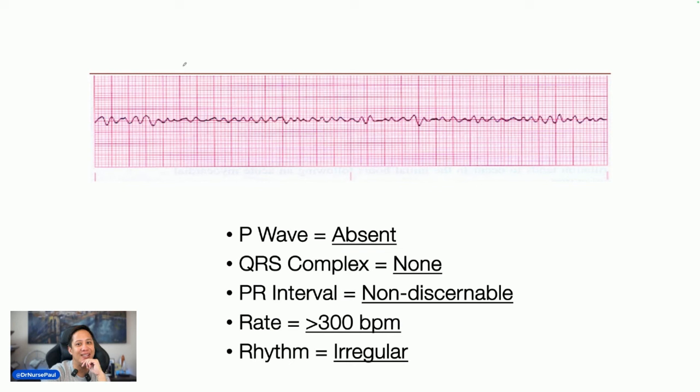What is that? You can't miss this. But sometimes if your EKG millivolts is set too low, you'll see it as a flat line. What you do is increase the volts. You can put it 1.5 times, 2.5 times, 10 times, so it's bigger and you can see the waves. But to cut it short, in the NCLEX, you don't have to worry about the machine. It's just going to show you a picture. It looks irregular. It looks chaotic. This is called ventricular fibrillation.